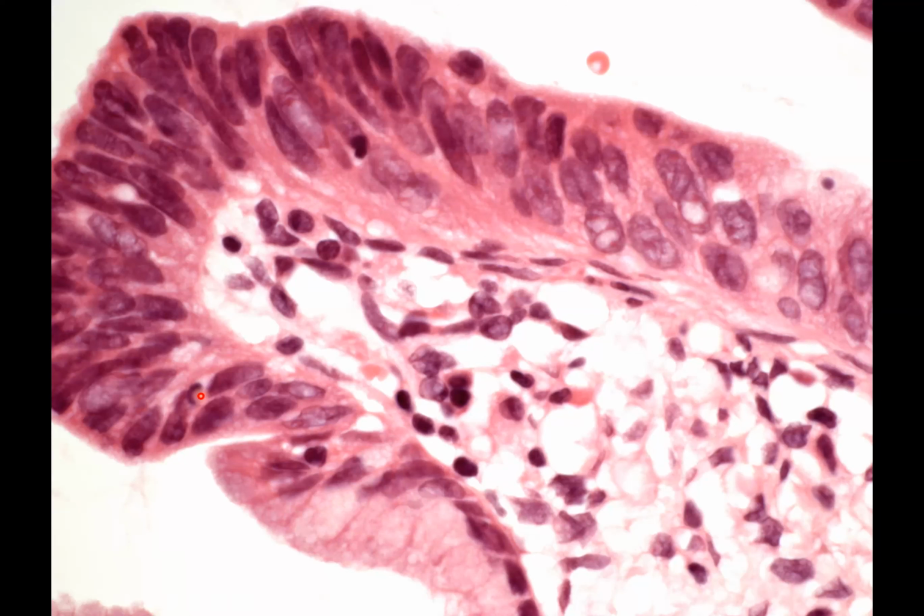And what's abnormal about here is now the nuclei look enlarged. You can see, for instance, this nucleus is about, I would say, 3 to 4 times the size of the normal ones adjacent. Also, there's a range, even on the H&E, you can appreciate, of chromatin variation in staining. So we've got some that look, I would say, fairly euchromatic, others which look much darker, and some which seem to have sort of vacuolated changes. And of course, we've got this pseudostratification where we've got nuclei fighting to get to the surface and a diminution of mucin.